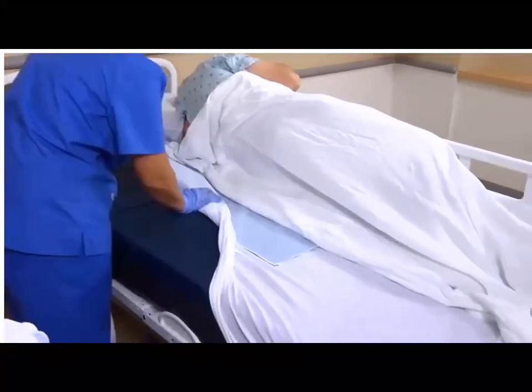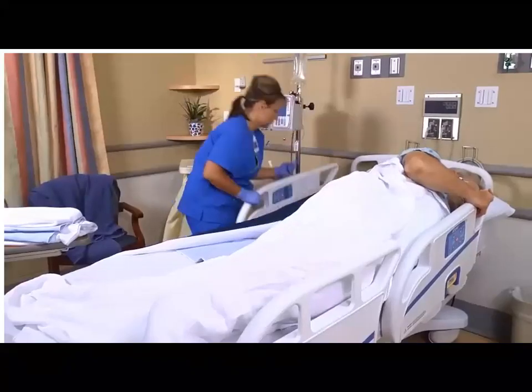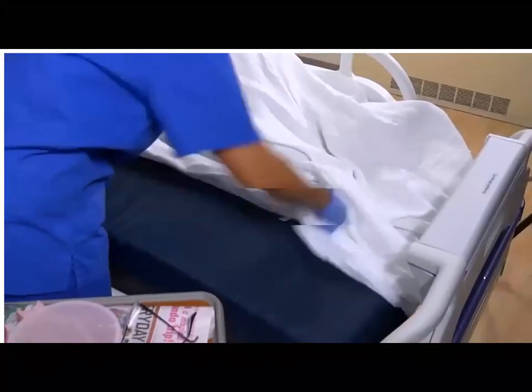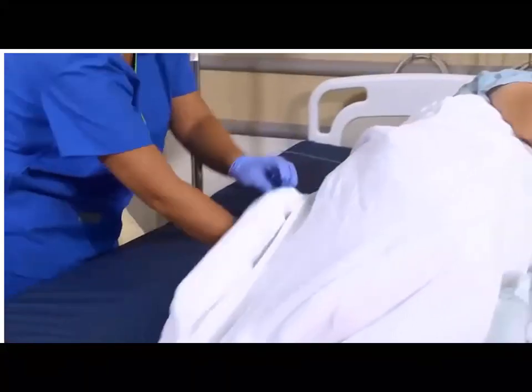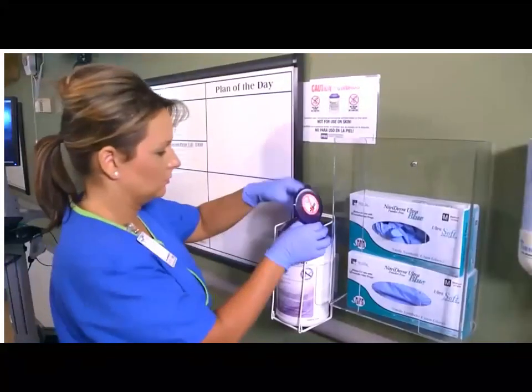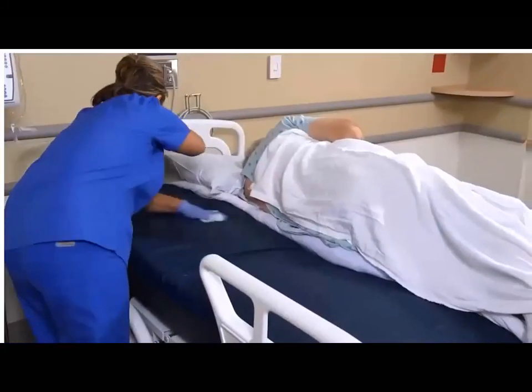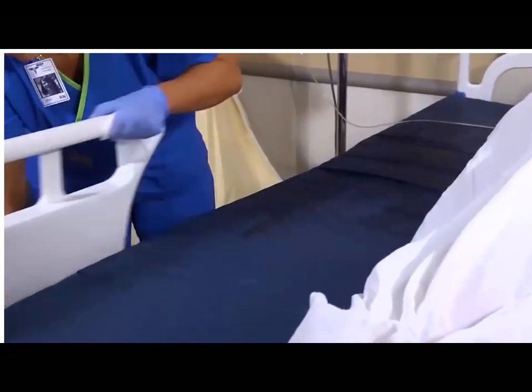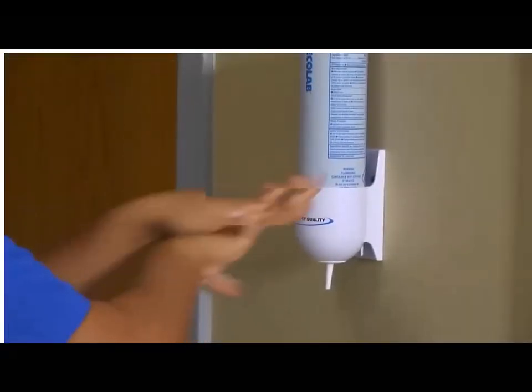Standing on one side of the bed, loosen the bottom linen, moving from head to foot. Fan fold or roll the bottom sheet and any optional linen toward and under the patient. Tuck the edges of the soiled bottom linen alongside the patient's buttocks, back, and shoulders. Then clean, disinfect, and dry the mattress surface if necessary. Remove your gloves and perform hand hygiene.